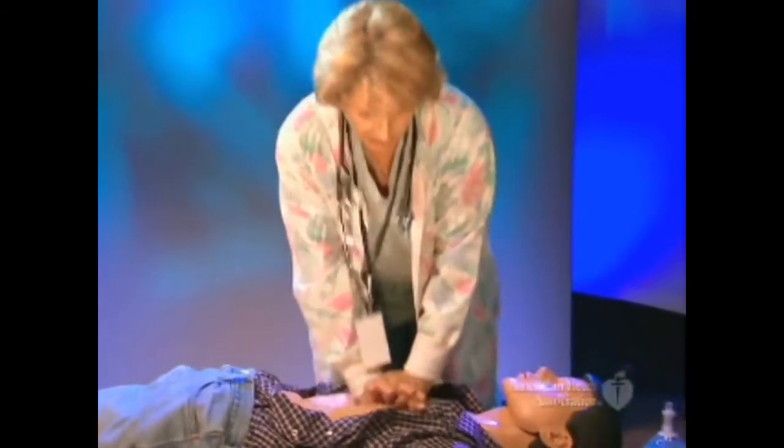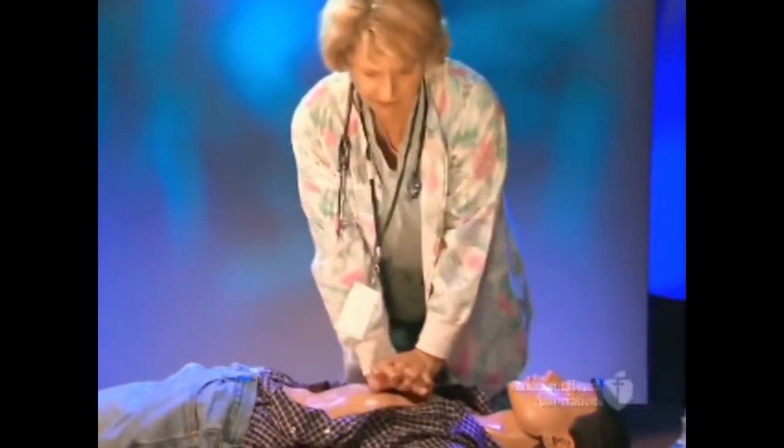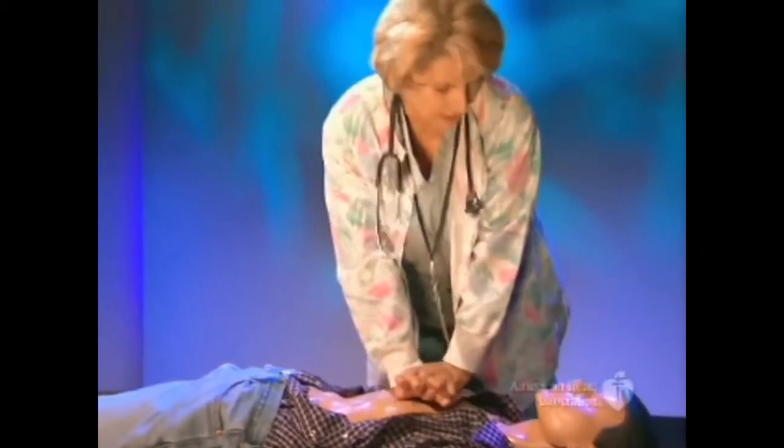Provide cycles of 30 chest compressions and 2 breaths, and use the AED when it is available.